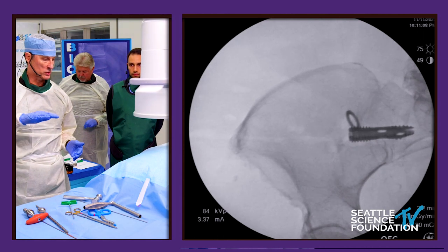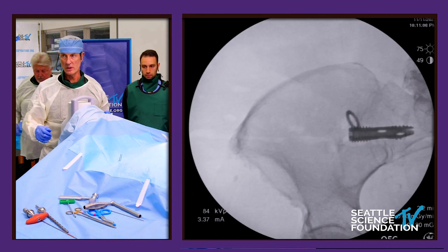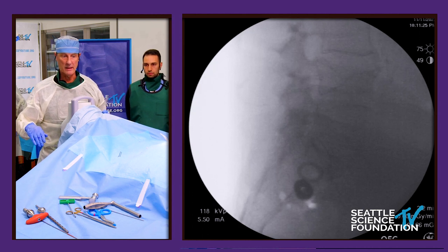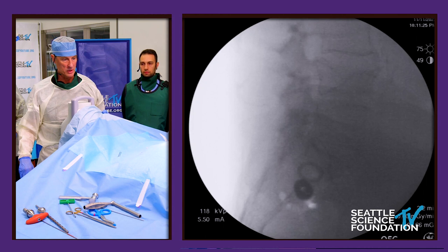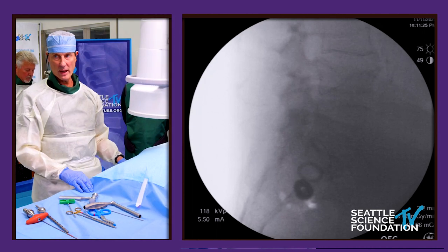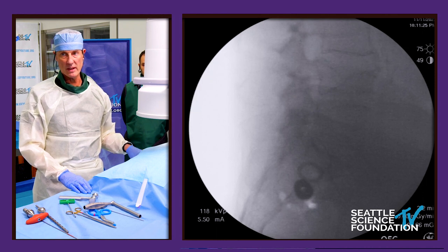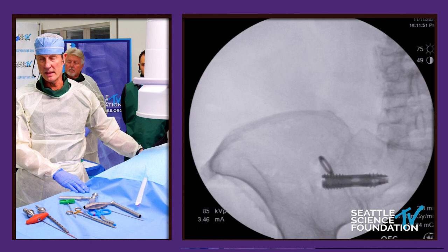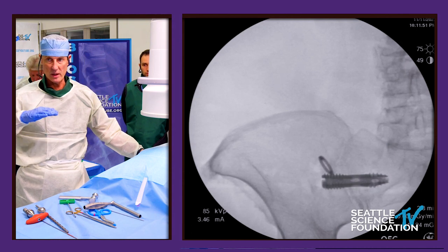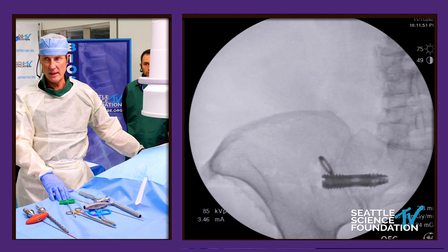So we'll put a screw at S1 through the S1 bony corridor, and a screw through the S2 bony corridor. In this cadaver, there is basically no bony substance in the ilium, but we'll put one at the S2 bony corridor. And then we'll put one in the S1 foramen — a short one, short of the foramen, usually a smaller diameter screw. These are 11.5 by 45. The bigger screws are 11.5mm in diameter; the smaller screws are 9.5mm in diameter. One of the most common combinations is 11.5 by 60 and 11.5 by 50 for S1 and S2 respectively, followed by a 9.5 by 35 for a short peraforamenal screw. And that is SI fusion.